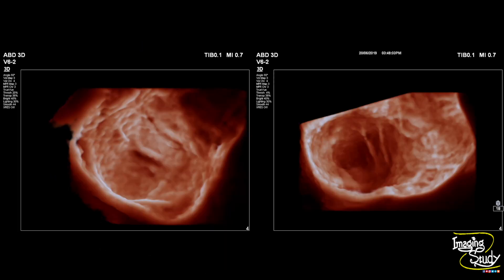These are the 3D pictures of the urinary bladder lumen and you can see multiple trabeculations. This trabeculated wall appeared as a polypoid lesion on two-dimensional B-mode ultrasound scan. This trabeculated bladder wall pattern confirms this as a case of chronic cystitis.